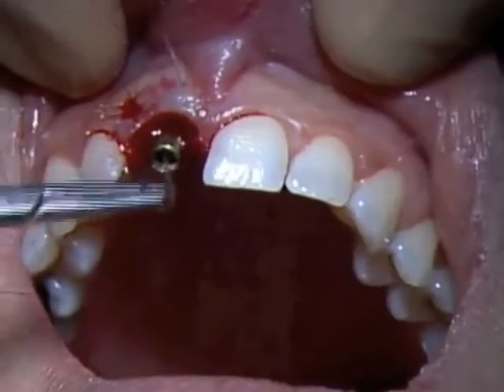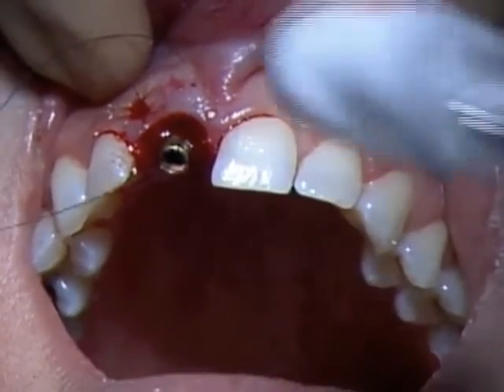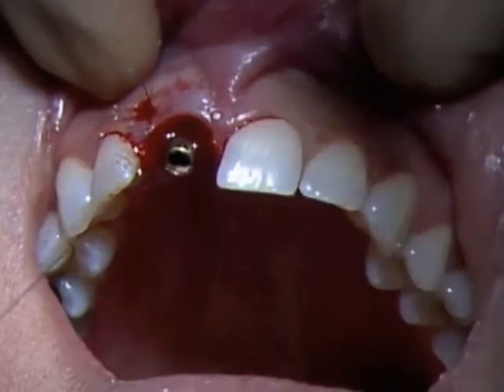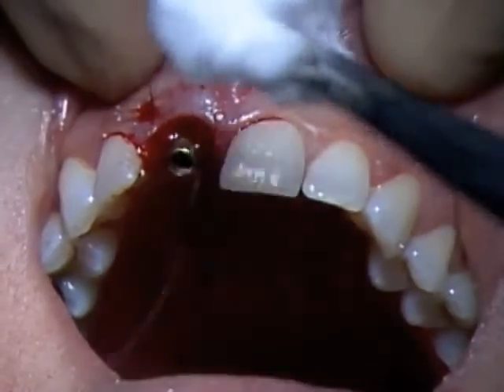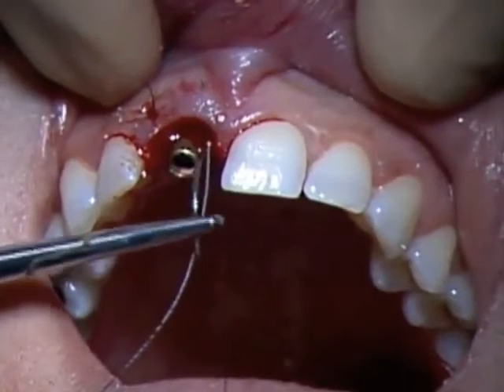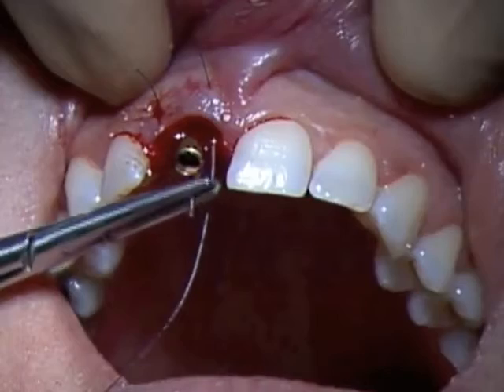We always place 2 vertical mattress sutures in this region. The distal one is already placed. We will see here the mesial one. You notice that we enter 1.5 to 2 millimeters above the free gingival margin and more centered to our implant body.